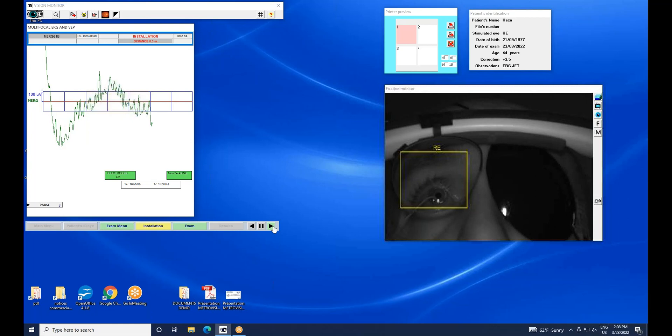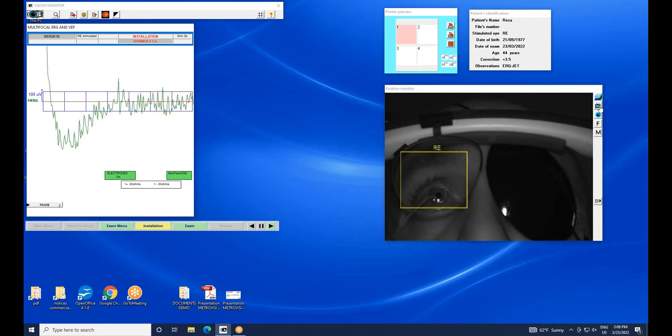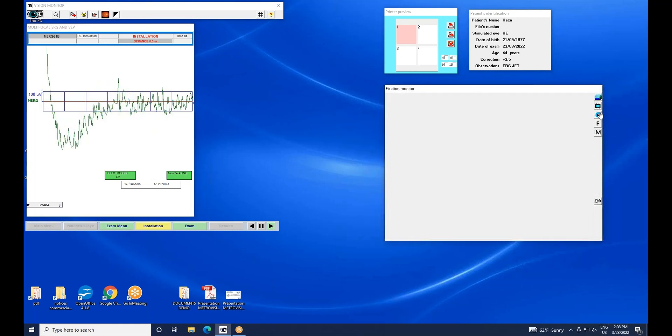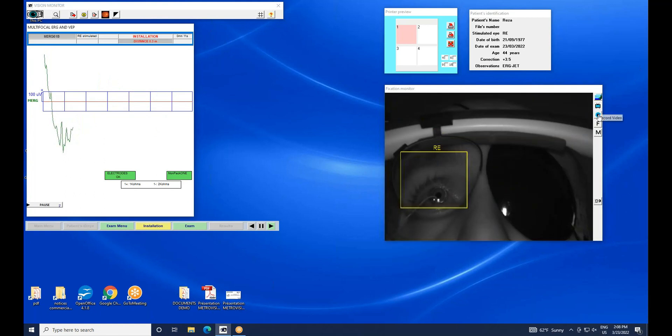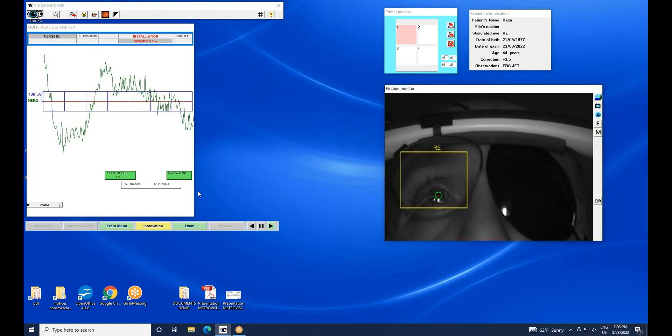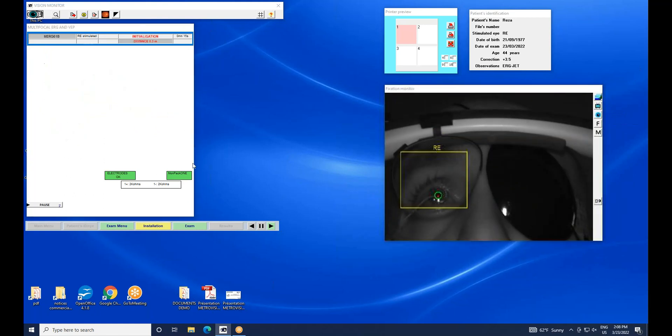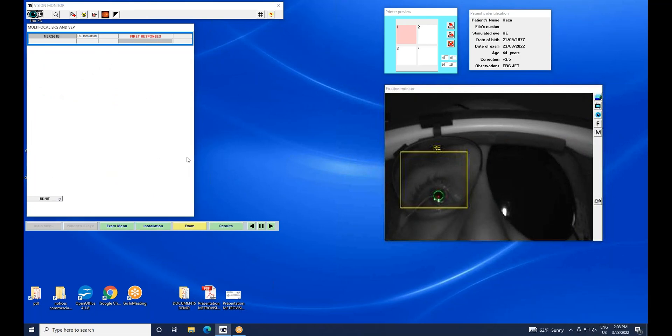Now the software displays the signal recorded from the amplifier. At the same time, the impedance of the electrodes is checked. I get a warning message in green color if impedances are below a preset threshold of 5 kOhms.